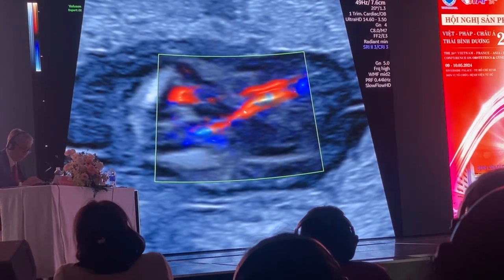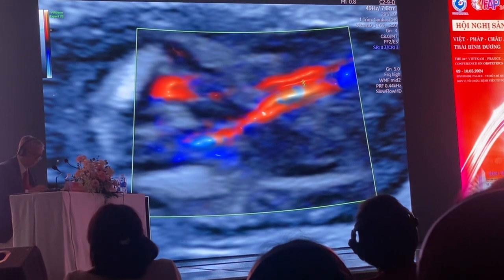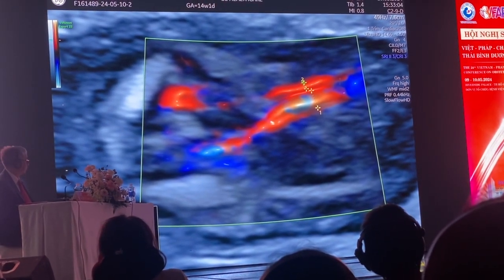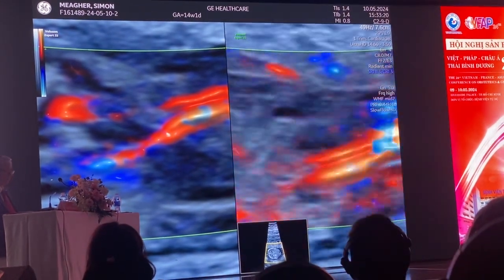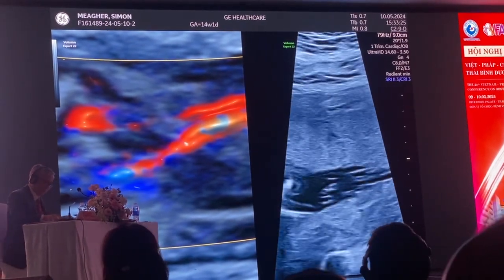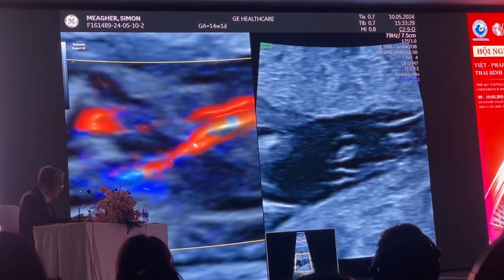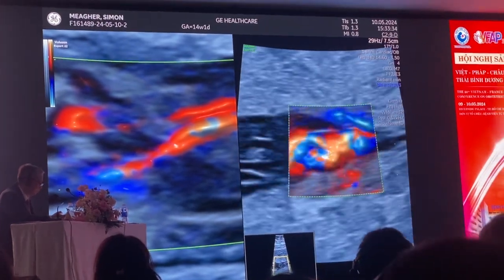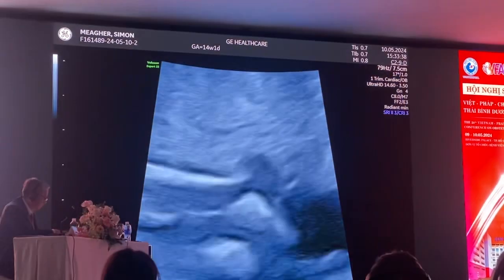The second thing that you also notice when you increase this is you see that this artery is bigger than this artery. And that's quite common. And when you see that in the first trimester, that there's a discordance in the size of the artery, then come off colour and just find a loop of free cord, and just look at a loop of free cord, and sometimes this can also help, sometimes, not always. And then you just look at a free loop of cord and ask yourself whether you can see the correct number of vessels on a free loop. And so that's just a quick trick.